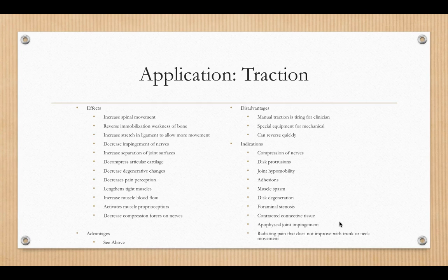We can usually then also combine traction, heat, massage, exercise, potentially maybe immobilization if they have other issues that they're going for. E-stim can help with some of the pain, things like that.